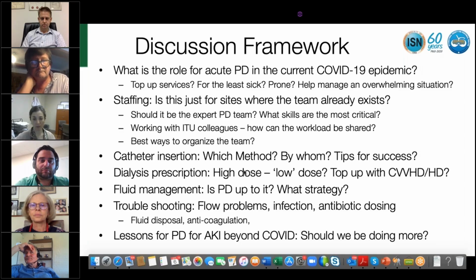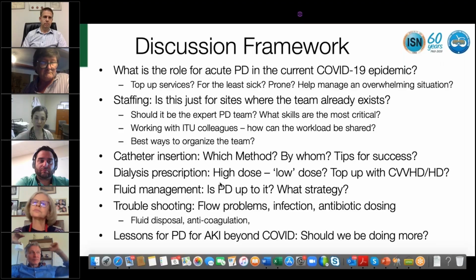And anyone with PD experience who actually chose to round with us. And once they got trained on the cycler, I always told them it's not rocket science. They were able to set it up themselves with some manual guides provided by the suppliers and the companies. And so it became easier after that first week in these makeshift ICUs. On the wards and the ICUs where the staff had some training, I feel like they helped each other, and we just provided oversight as the PD nephrology team. We went around and provided oversight, but it worked surprisingly well.